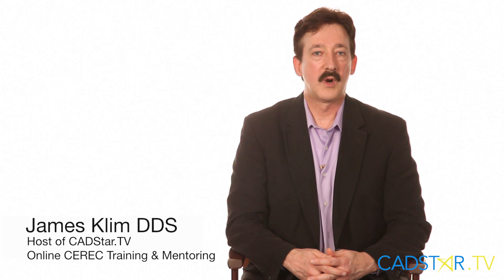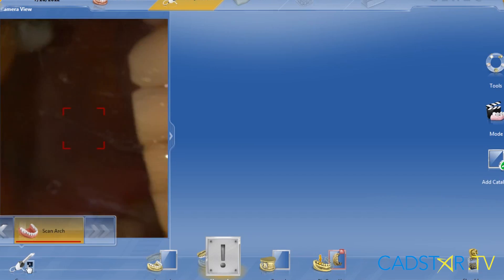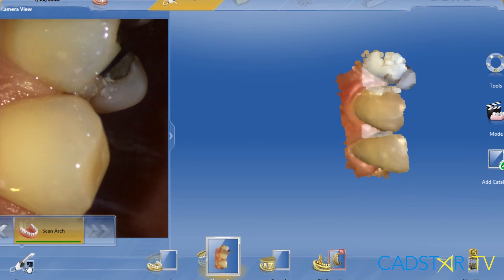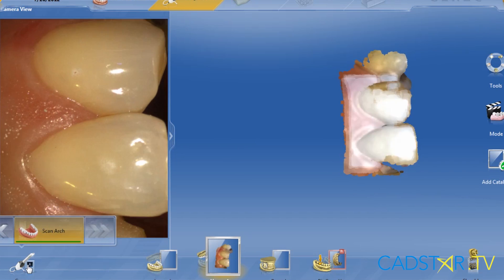I really like CEREC 4.0 for anterior teeth. This is where I can copy in a wax-up or a mock-up. The OmniCam provides even more flavor to the process. Acquiring digital images with the color streaming of anterior teeth has never been simpler. Simply place the camera over a labial surface and start the color streaming process. As you move the camera, as you would an airbrush over the surfaces, you will see your virtual design come alive.